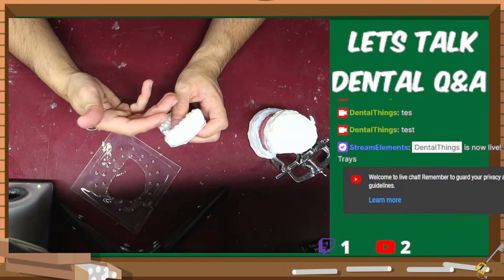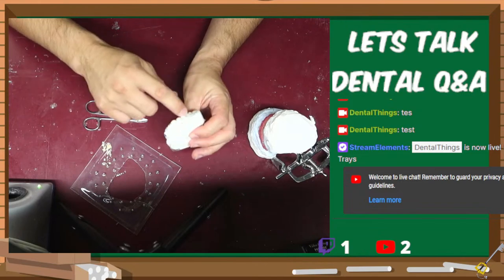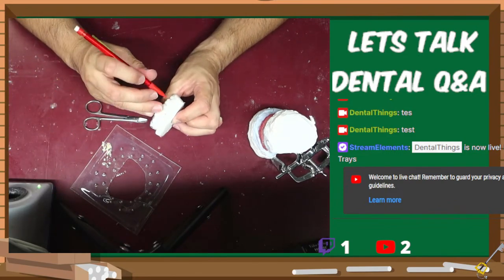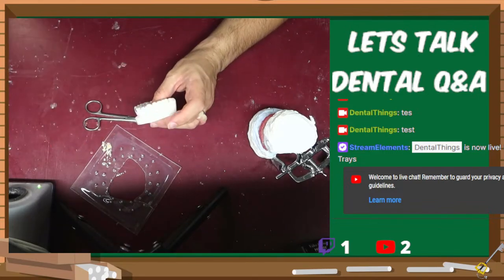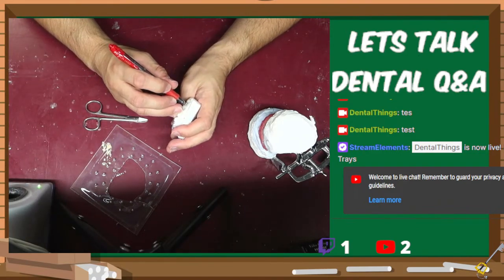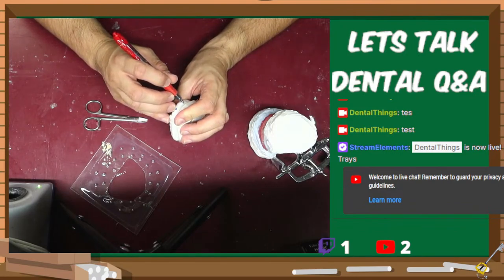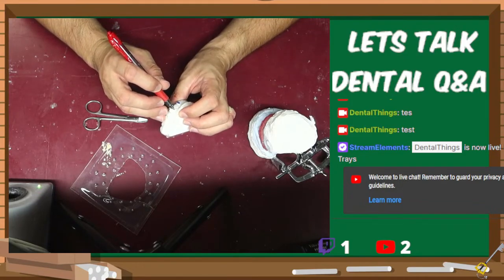And I can do a couple different cuts, like a wavy cut that goes in and out of the teeth, or I can do a straight across the gums cut. And so, let me see if I can mark it just a little bit, so I have a guide later. But usually the safest version to start off with is going to be across the gums cut. So I'll just do a gentle marking. And if it bothers the patient at that point, then we can always cut it back if we need to.